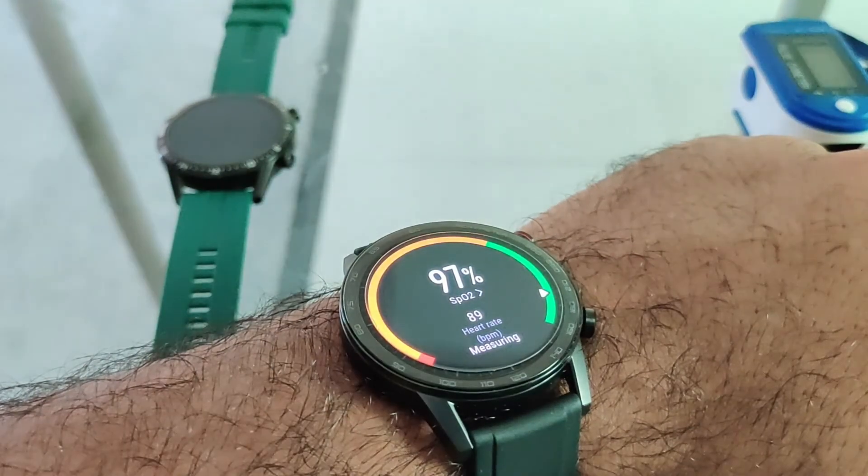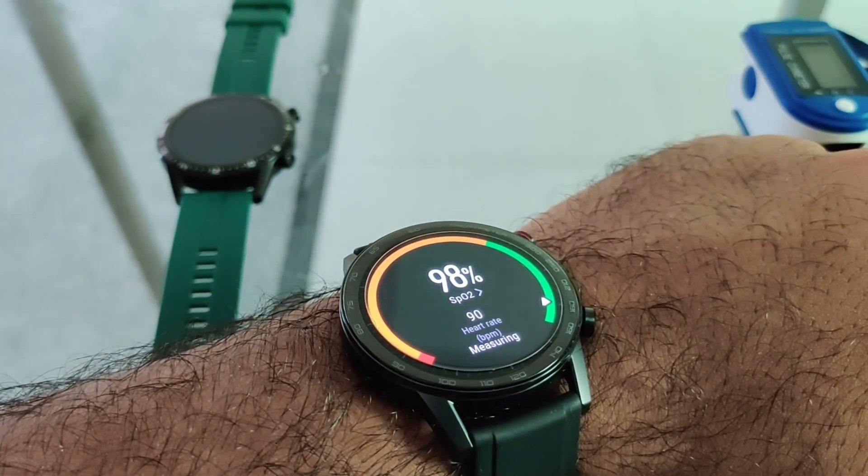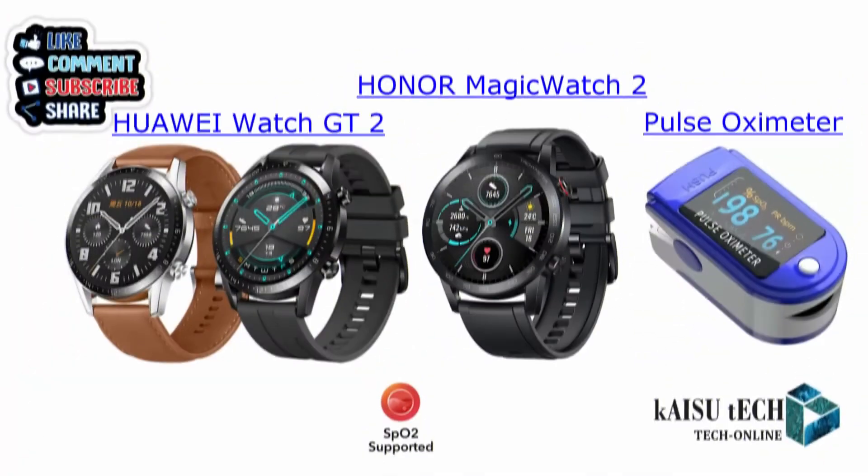Now that we are all set, we are finally getting good results from the Honor Magic Watch 2. In comparison, I would prefer the Huawei GT2, which gave me results in the first attempt.